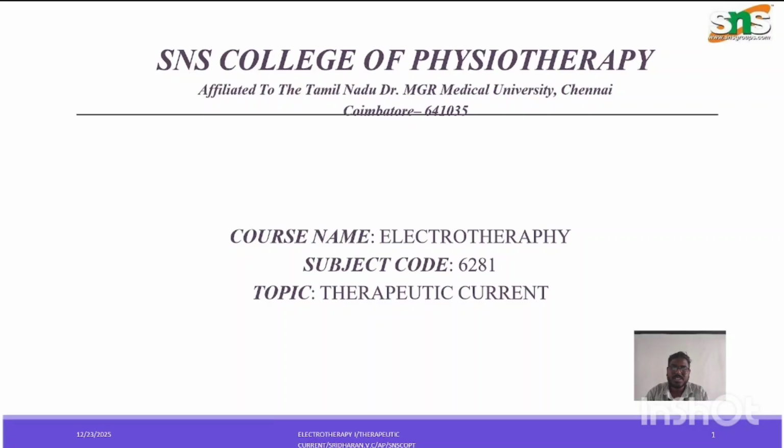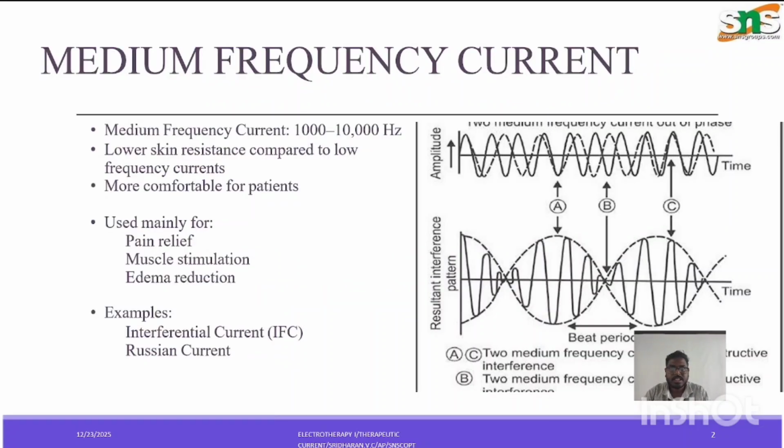So in this video, we're going to see about the topic therapeutic currents, which comes under the course of electrotherapy. In therapeutic currents, in this video, we mainly concentrate on the topic medium frequency current. So what is medium frequency current?